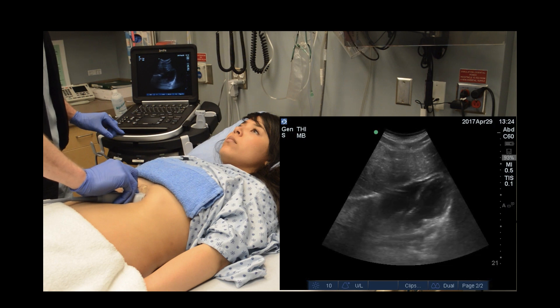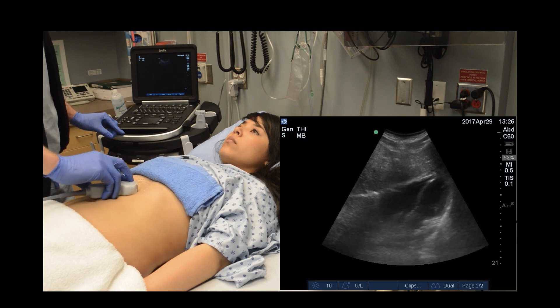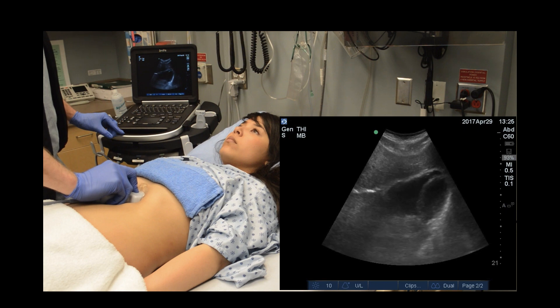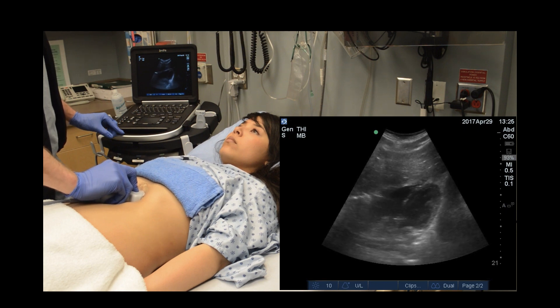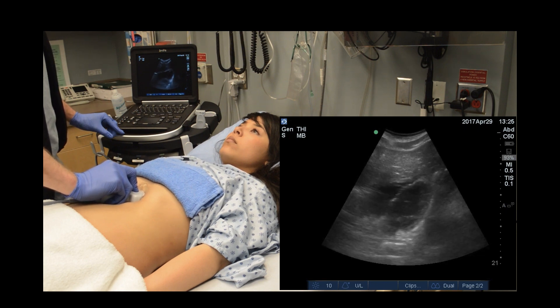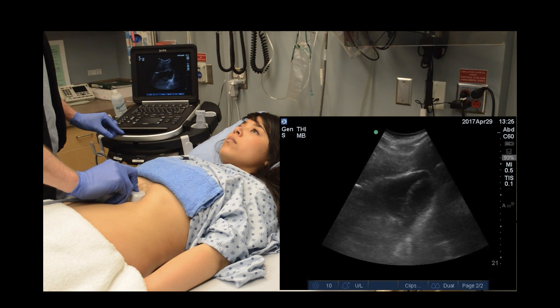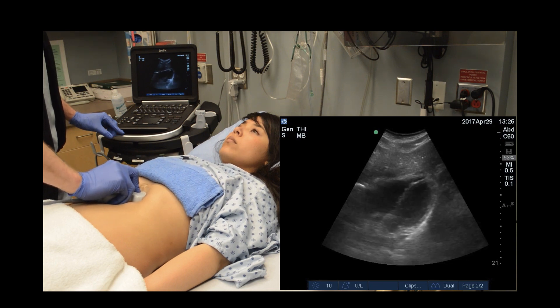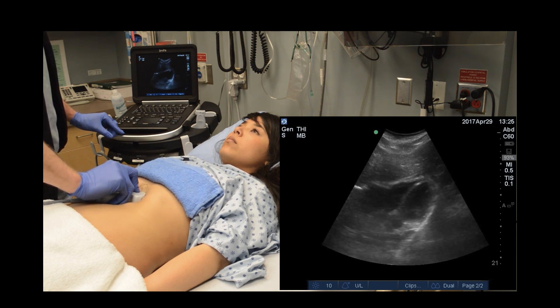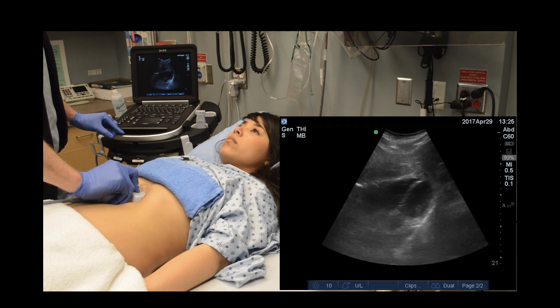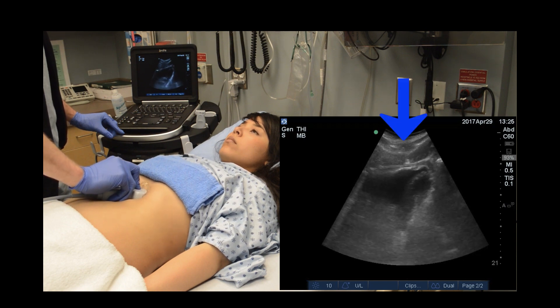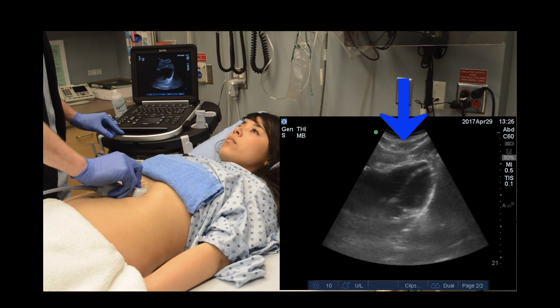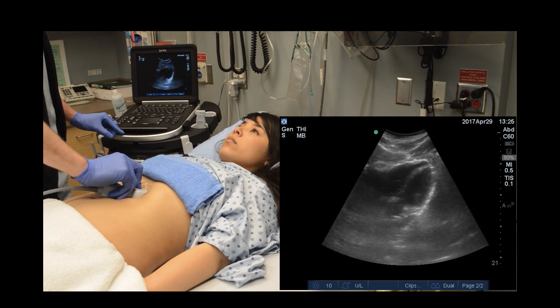If the heart appears too bright, just turn down the gain. If it appears too dark, first make sure you have enough gel. Second, make sure you are applying enough pressure both posteriorly into the abdomen and superiorly towards the heart. Third, have the patient take a slow deep breath to flatten the diaphragm and bring the heart towards the probe. Lastly, if needed, you can adjust the gain.